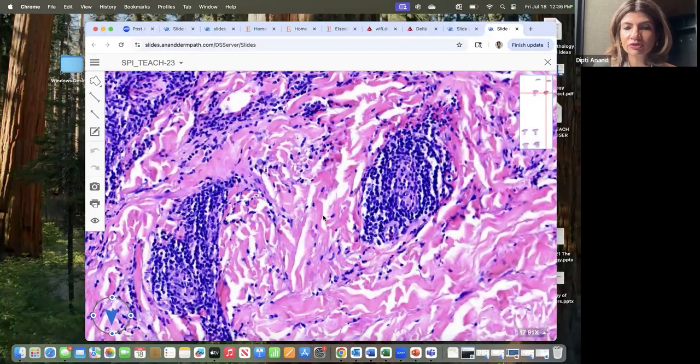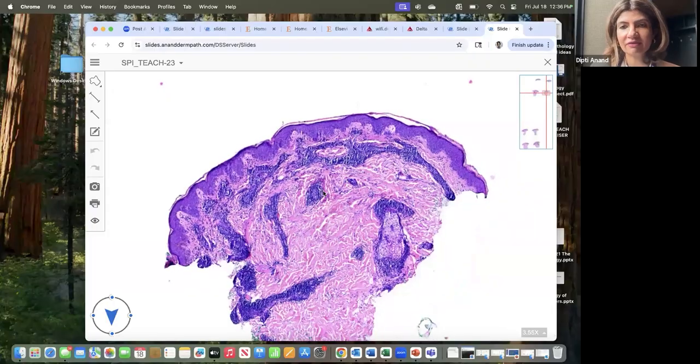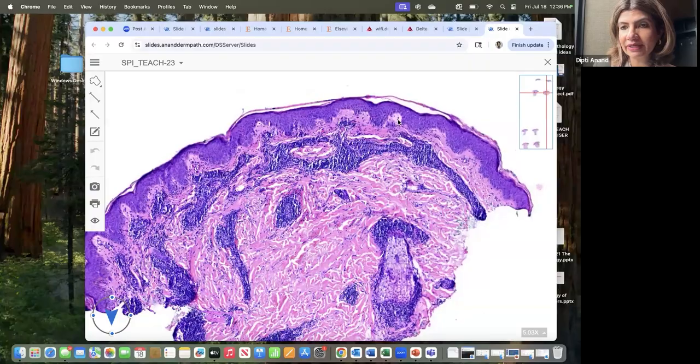And what I'm seeing over here is basically no eosinophils, right? So now I'm in the 5Ls: the lupus, lichen striatus, syphilis, pityriasis lichenoides, and so on and so forth. The reason this is not lupus is because I'm seeing dermal edema, right? There is dermal edema and no chronic interface change, which we will talk about later. So it's not lupus. You're not seeing any lichenoid change. The epidermis does not have the lichenoid change you would see in lichen striatus, right? With lichen striatus, you're seeing dermal edema, which is unlikely in syphilis. So that is also out.